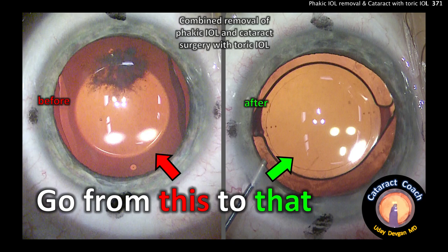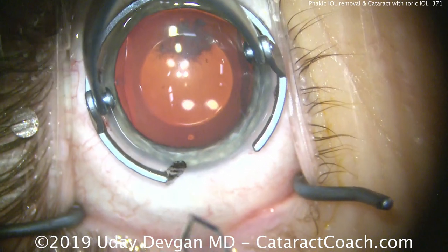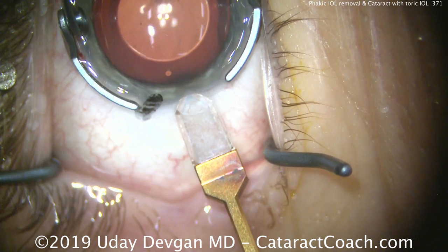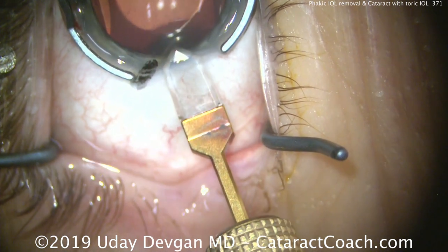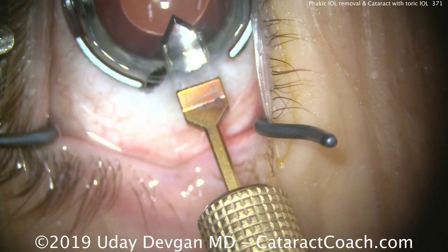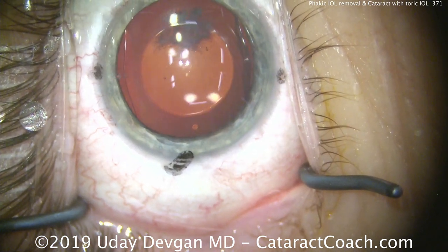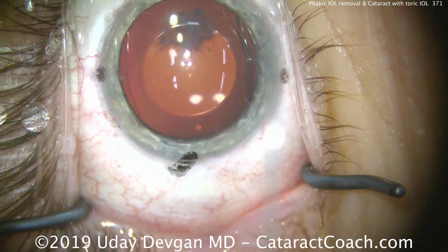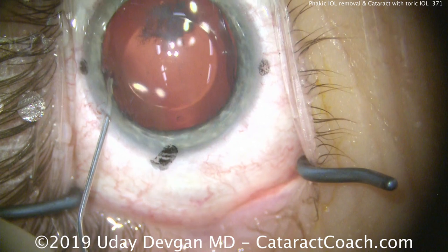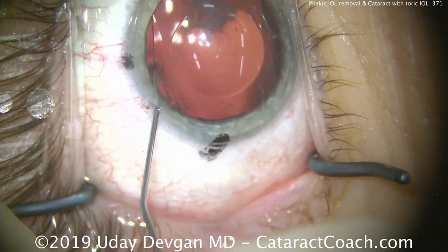Combined removal of a phakic IOL and cataract surgery with implantation of a toric lens. This patient has a phakic IOL in the posterior chamber. The patient had this surgery more than 10 years ago, and it served her very well for many years. But at this point, that phakic IOL is touching the anterior lens capsule, causing a very large central opacity that's obscuring vision and causing difficulties with day-to-day tasks such as computer work, paperwork, and driving.